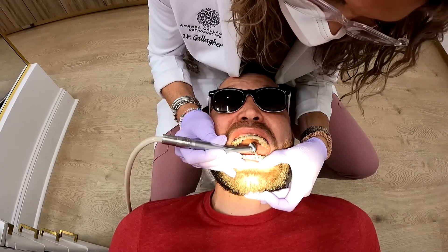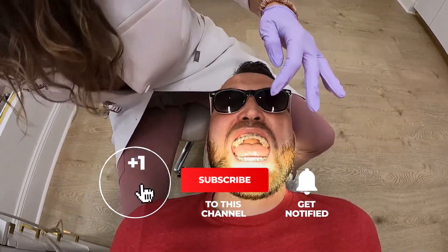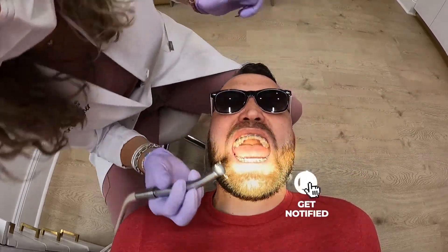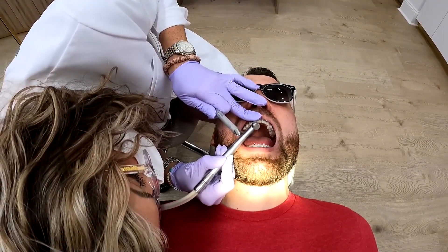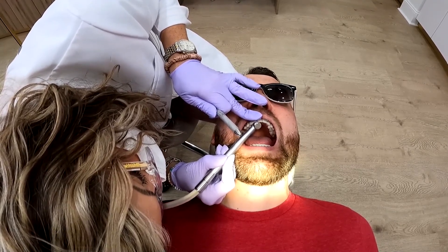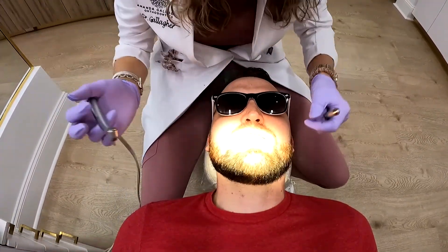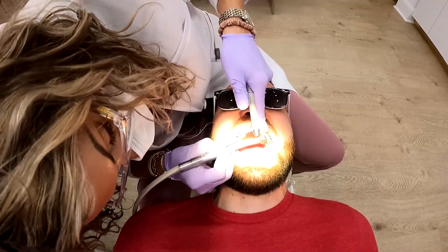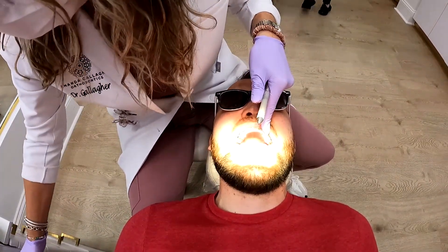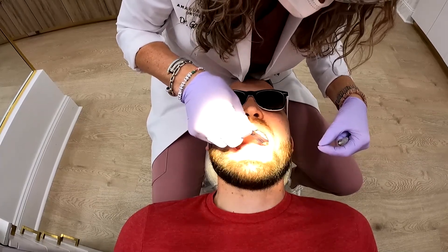This taper just highlights where you're contacting a little bit heavier. Bite together. Does it feel different at all? It may feel a tiny bit different. And even after the braces come off, we do a little bit more of this too, just to fine tune that bite. Let's check with the paper again — tap, tap, tap and grind. Go ahead and grind. That's better there. Bite together, hold and grind. Perfect.